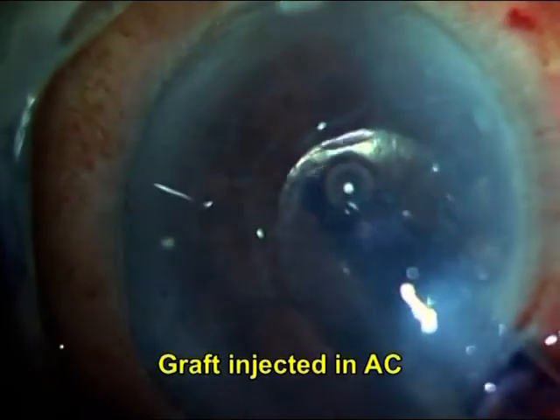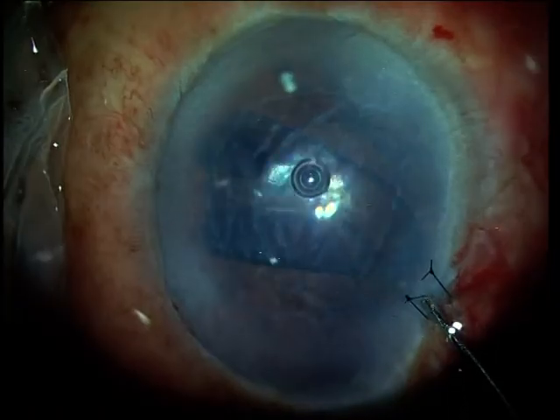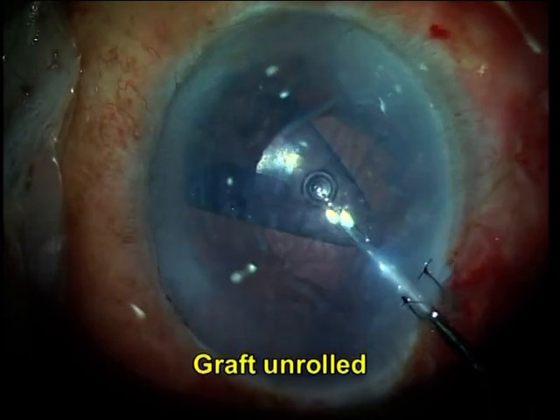The graft is injected into the anterior chamber with the right side up, meaning the rolled-up margins of the graft face toward the cornea. The wound is sutured to avoid accidental slipping out of the graft.